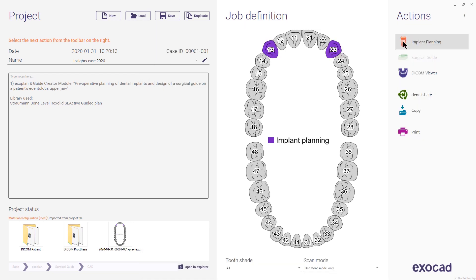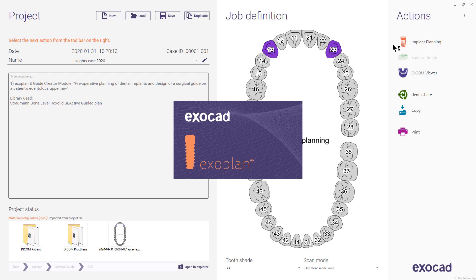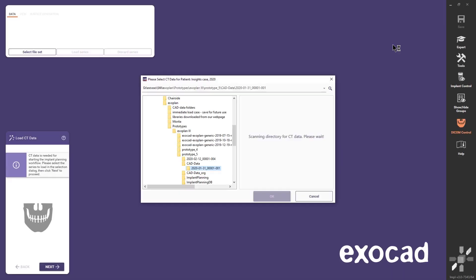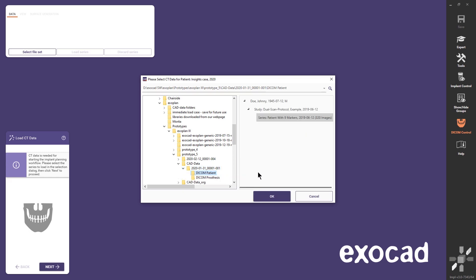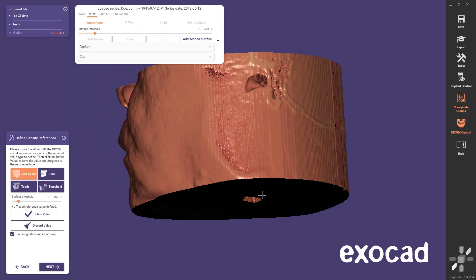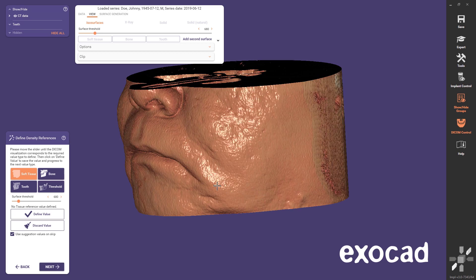Now I'll start the implant planning. First the software asks me to load the CT scan of the patient. When I've done this, the software automatically continues to the next step where I can define density references for soft tissue, bone and enamel, as well as set a threshold for denser parts to be shown in blue color. Since Exoplan saves the values I used last time, I don't need to change anything if I don't want to.